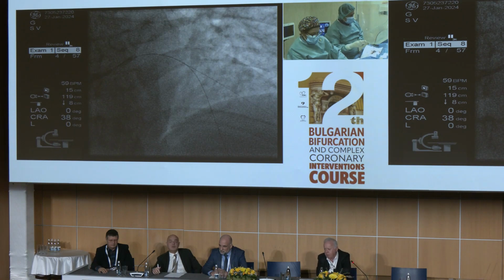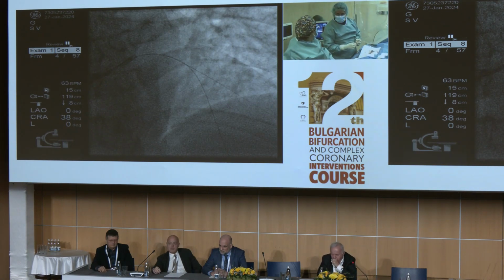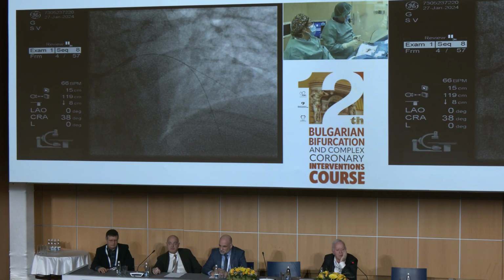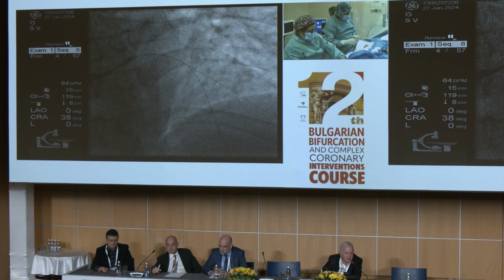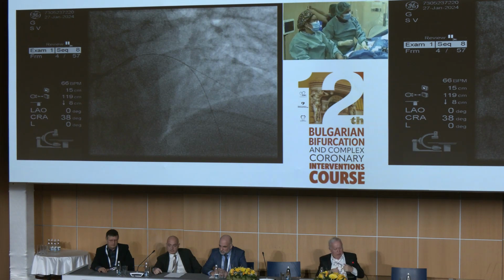You mean by QCA right now? Yeah. Is that possible in the cath lab, measuring by QCA the diameter distal and proximal to the bifurcation? Yes, but someone has to do it for us outside. That's perfect. Just give me the data. And we'll ask Dr. Gelev.